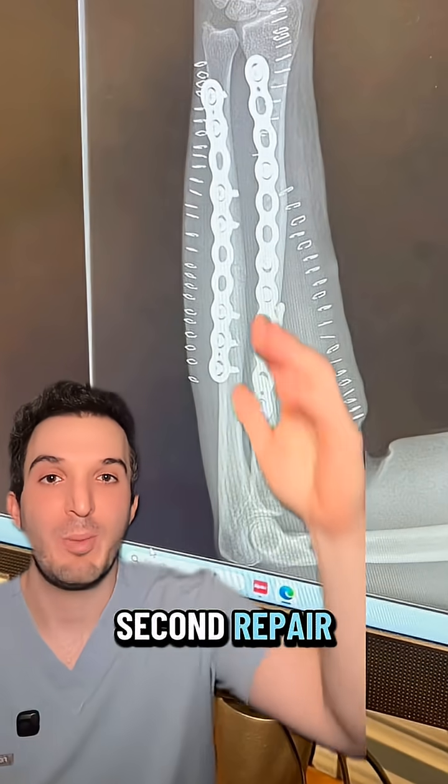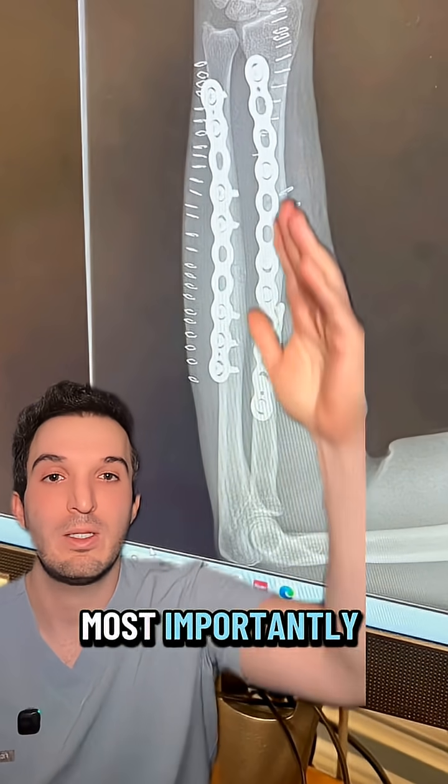And here we are after the second repair. You can see nice new hardware. Most importantly, straight bones.